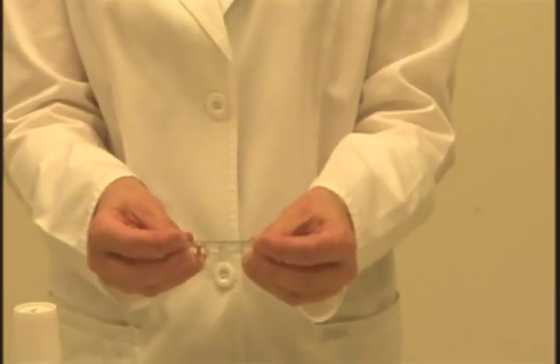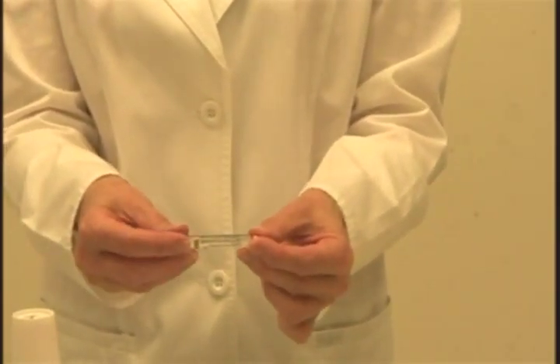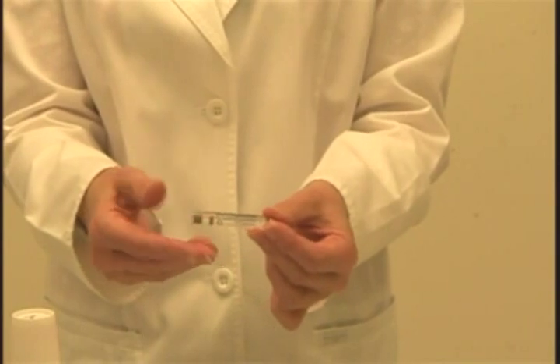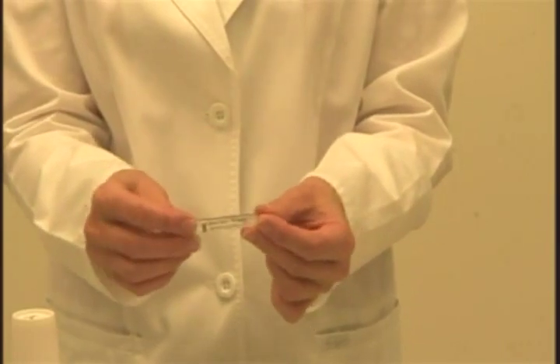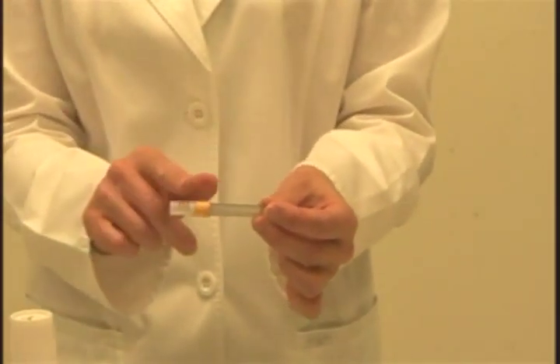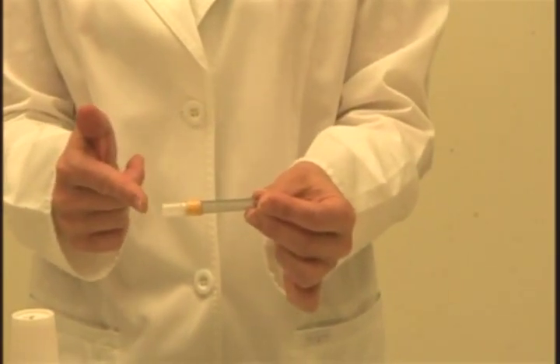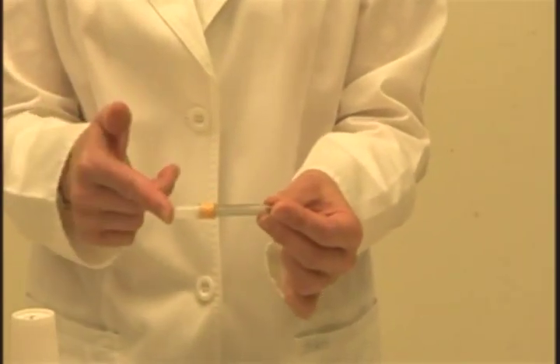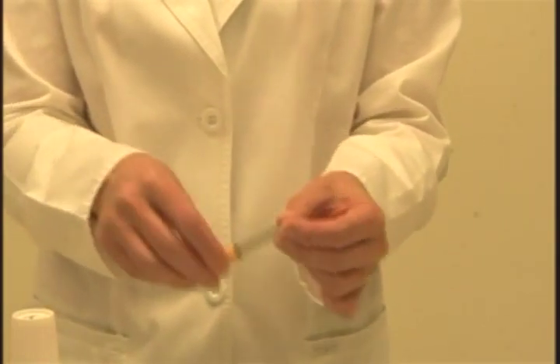I have an anesthetic carpule. The operator giving the injection should determine which anesthetic is selected for the procedure — this depends in part on the type and length of the procedure, but also on the client's health history and any contraindications to particular anesthetics. We have a disposable needle, and there are different lengths and gauges. The operator may have a preference depending on which arch and injection site is being used, so find out from the operator what type of needle they prefer.